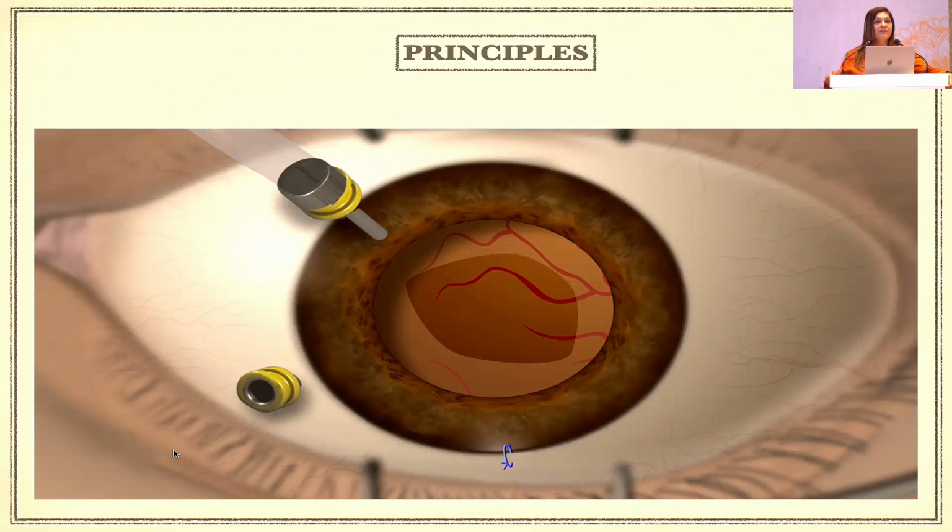So you will need to do a vitrectomy. I think all the surgeons who have not lifted their hands should move into doing vitrectomies if you are a cataract surgeon. Everybody has a complication. If you say you do not have a complication, it means either you are not operating or you are just lying. So we just need to accept this fact and move ahead.